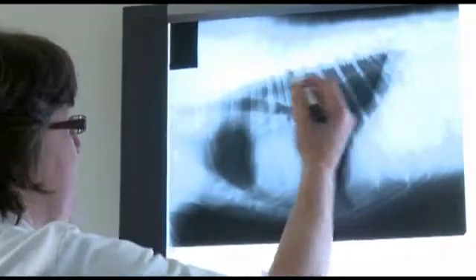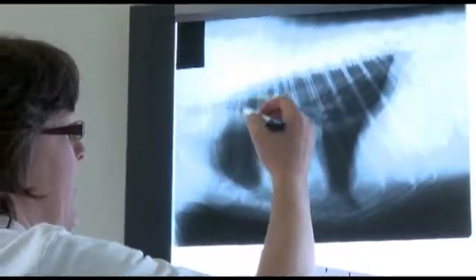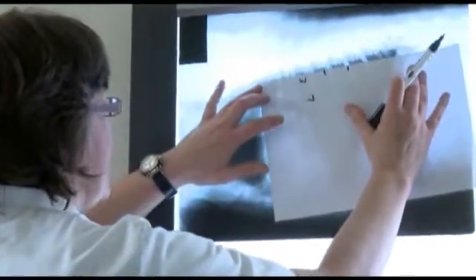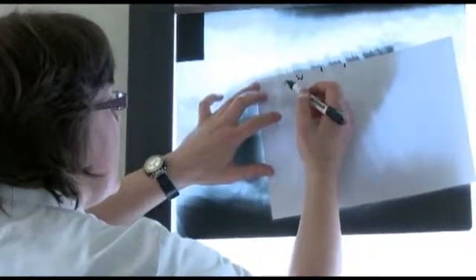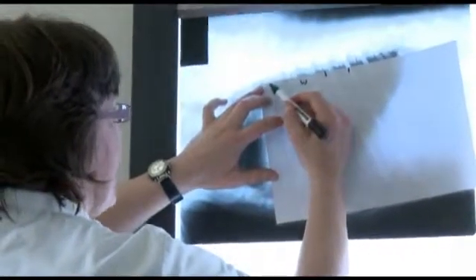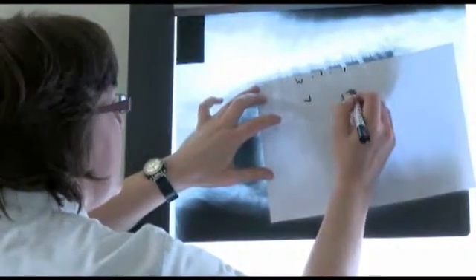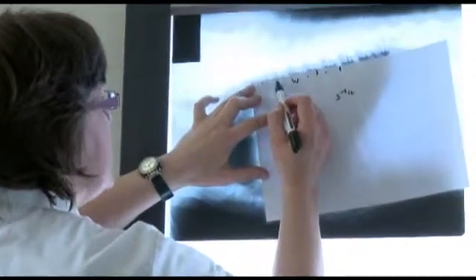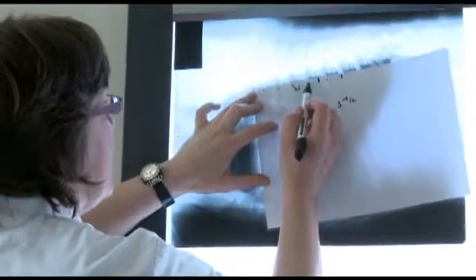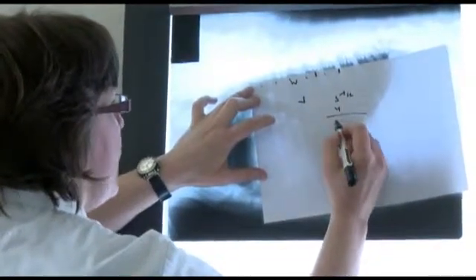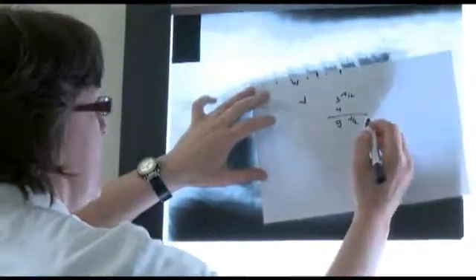We will then use the same piece of paper and lay it against the vertebra, measuring from the fourth vertebra onward. That means we need to have three rib pairs before that. We can measure up to one-tenth of a vertebra how many spaces we have. So one, two, three, four, five, five and a half for the length. And for the width, one, two, three, four. So a total of nine and a half vertebra, which is within normal limits for this breed.